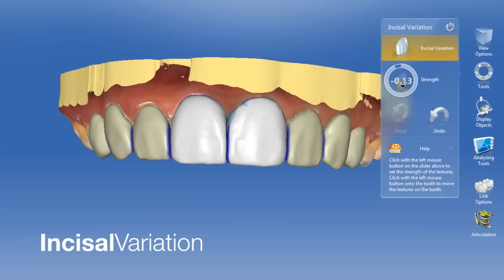During the proposal stage or the design stage, we have an incisal variation feature where we can scroll through different textures and incisal edges to customize each of the restorations.